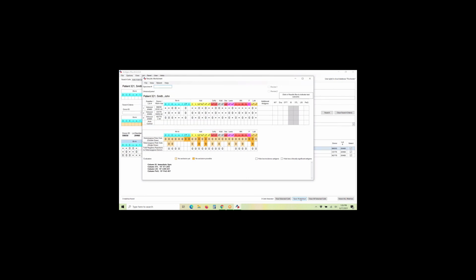So here comes your patient across, so you can put your results in. And now you would simply start putting in results to your keypad. Most people aren't doing auto controls on screens, but if you did, you can put it in now. In my case, I'm going to do immediate spin, and I'm going to do PEG as a panel, as my IAT reagent enhancement. All right. And then I'm just going to use the 2+ because I didn't set up the check. I'm just going to use the 2+. And so once you have this screen entered, you just come over to the top here and you do File and you save your panel.